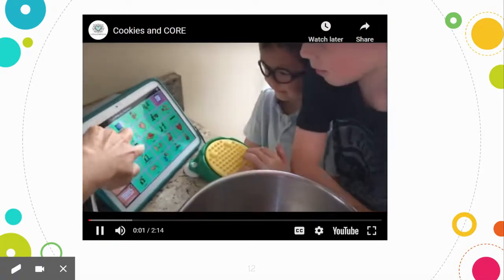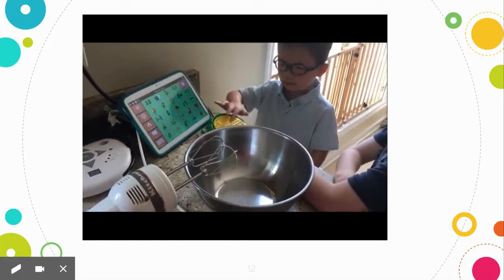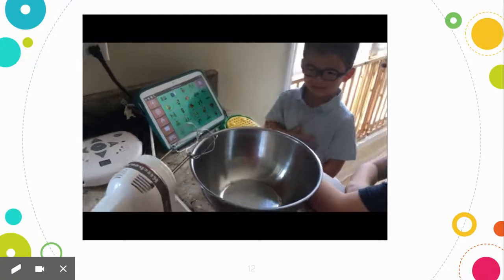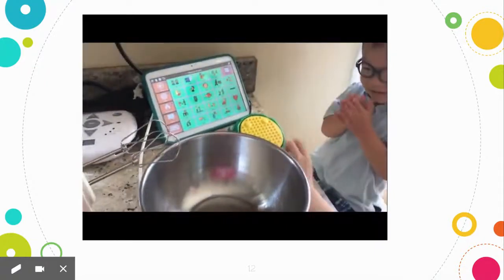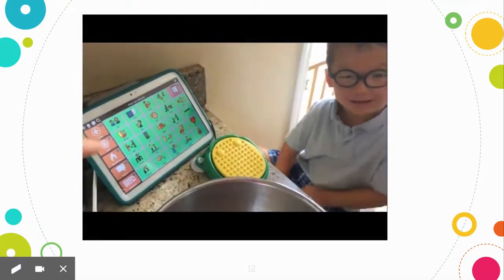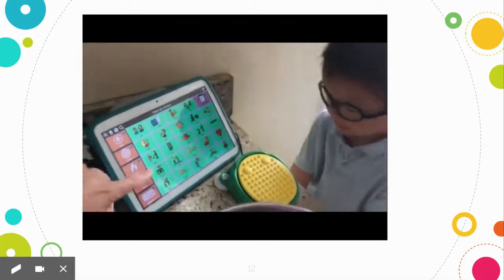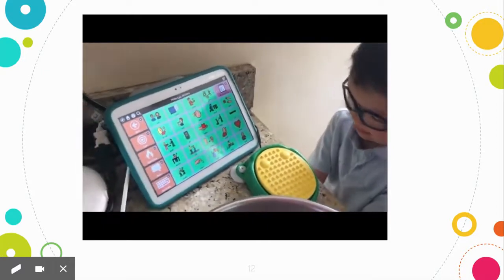You make it go? Go. Make it go. Yay! Good job, Philip. Do you know what we're going to make? Make. What are we going to make? Make. Do you know? No. You don't know? No. That's okay. I'll tell you.